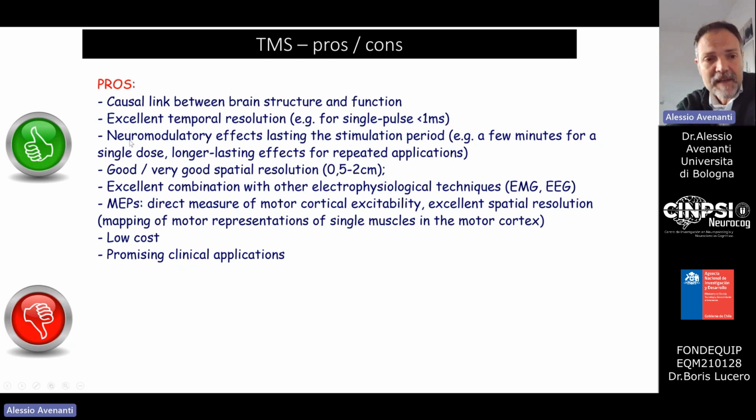When delivered in a repetitive manner, TMS can induce neuromodulatory effects that last for a few minutes after the end of stimulation. And as we have discussed with the stroke and Alzheimer's disease examples, we can even induce longer lasting effects when using repetitive sessions of stimulation, repetitive application.